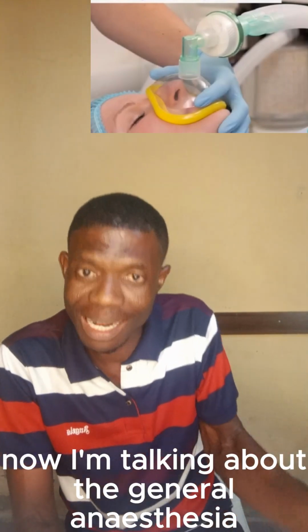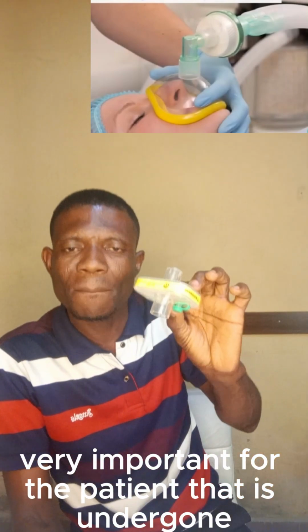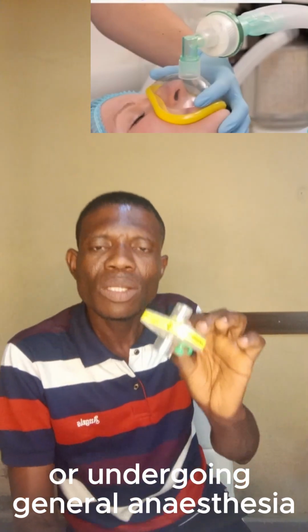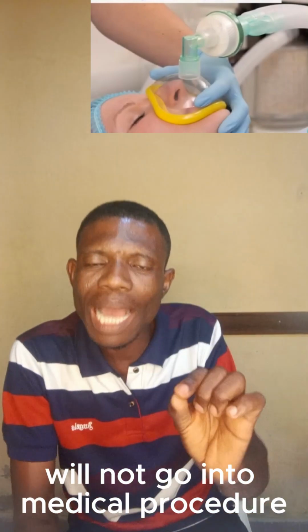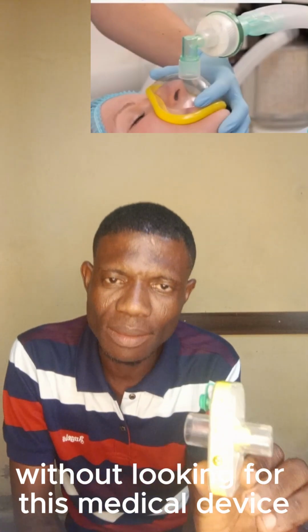I'm talking about general anesthesia, and that is why it is very important for the patient undergoing general anesthesia to have this device used. So ideally, an anesthetist will not go into a medical procedure in the operating theater without looking for this medical device.